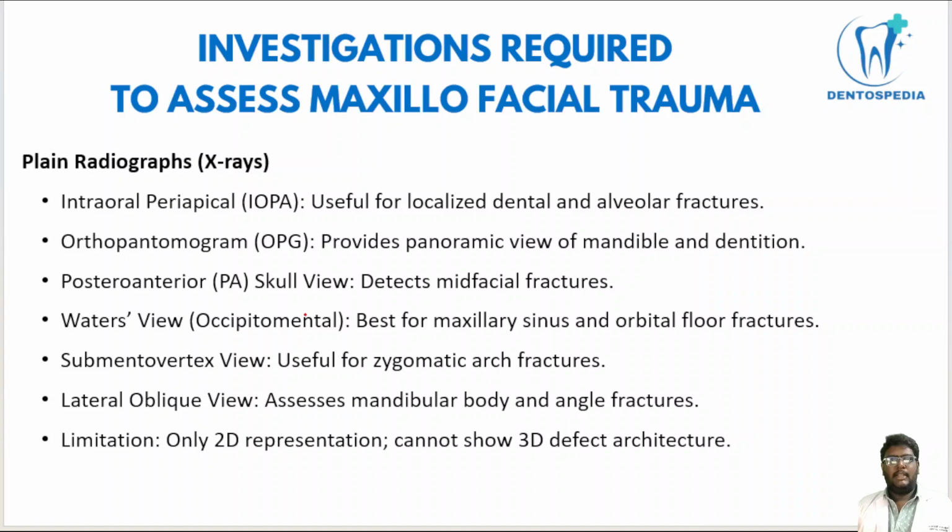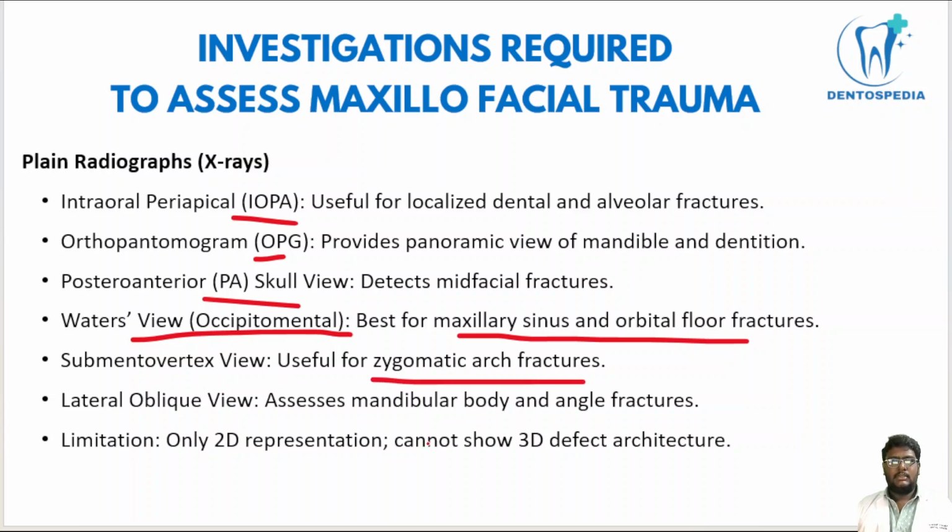Okay, and coming to the investigations commonly used for assessing maxillofacial trauma, IOPA is the least useful. Okay, and OPG is the most common one which we commonly prescribe. PA skull view based on the need. Okay, and Waters view is best, and it is mainly useful for maxillary sinus and orbital fractures. Submentovertex view for zygomatic arch fractures. Lateral oblique view of the mandible for angular fractures. And when compared to 2D radiographs, 3-dimensional radiographs give more information regarding the fractures.